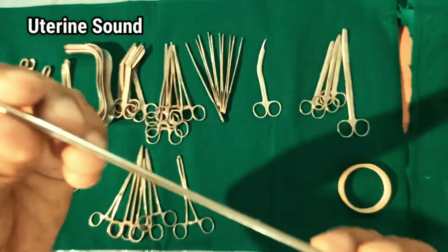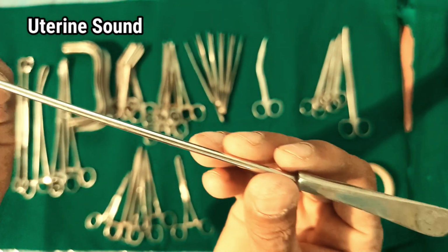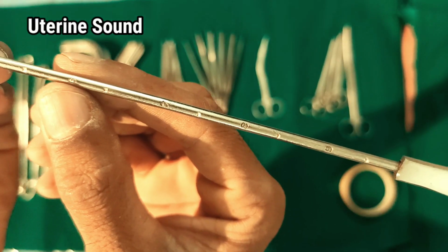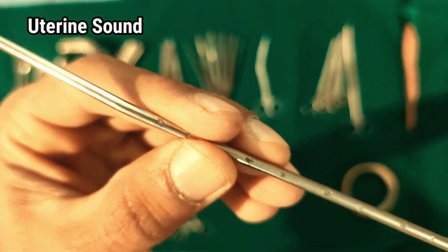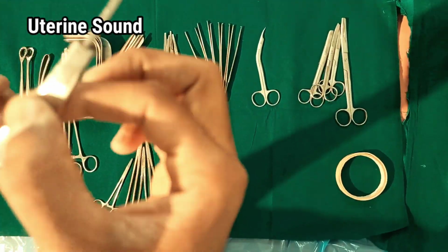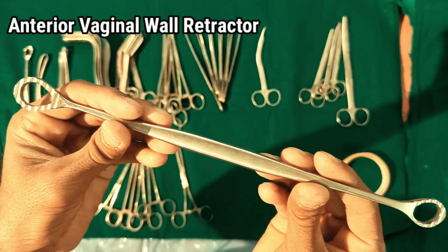The uterine sound. The uterine sound is used to gauge the depth and position of the uterine cavity. It is also helpful with the placement of intrauterine device and the verification of intrauterine position and length for hysterosalpingography procedure. Anterior vaginal wall retractor.